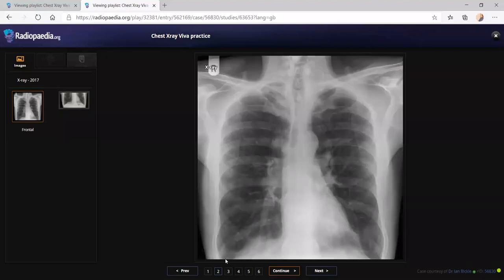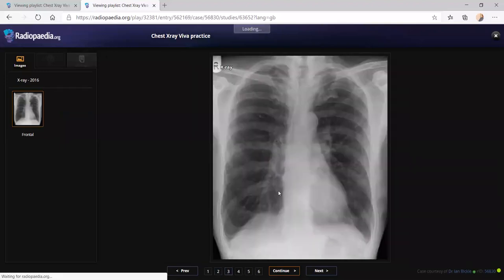That's okay. And you said that you will compare with the previous film and found that there was no lesion in the film from one year before, and no lesion there also. So in one year, you have to definitely think about a malignancy, especially since he's a smoker, and the smoking history was given.